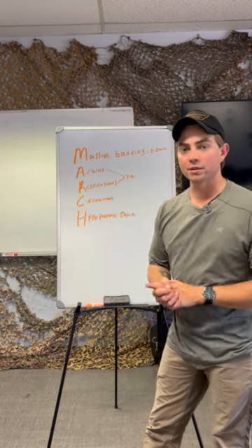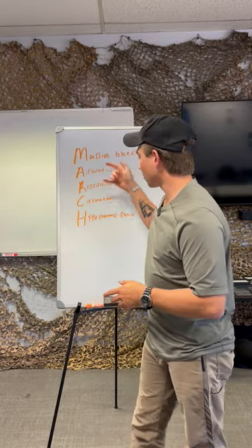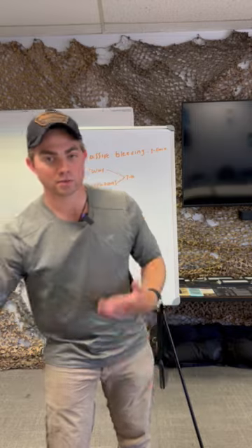MARCH, right? We want the massive bleeding control tools the most accessible and easily accessible, followed by airway and respiration related interventions, and then circulatory and hypothermic shock, right? So the algorithm's there, just stage your kits based off that. So let's take a look at an example.